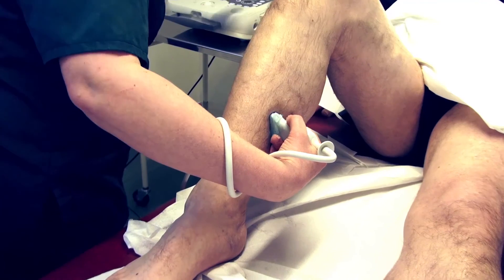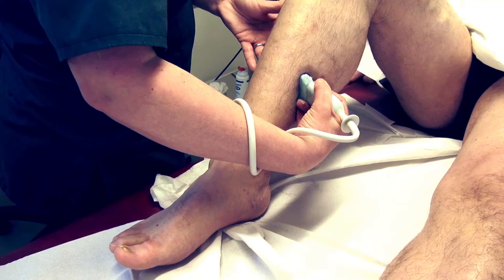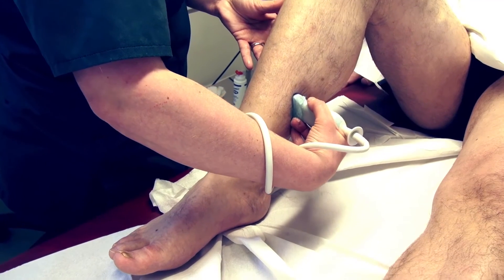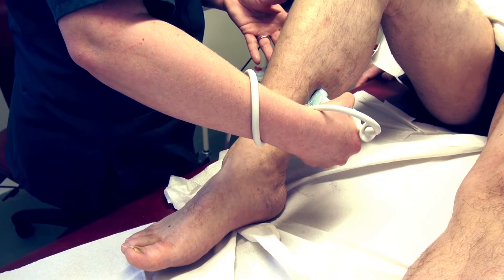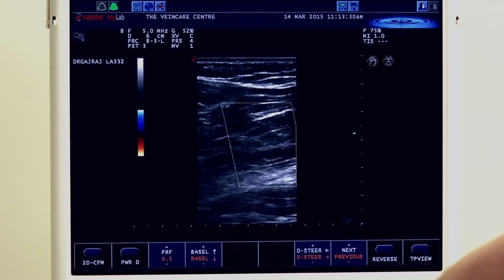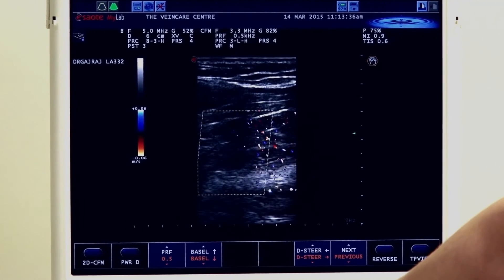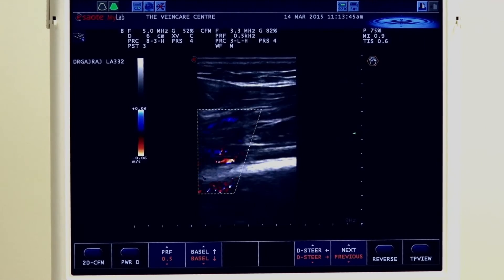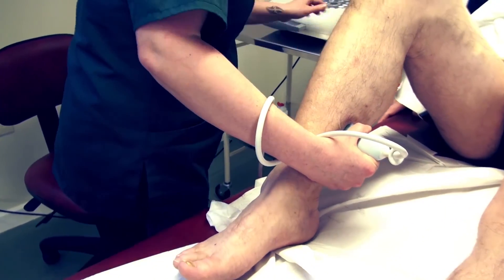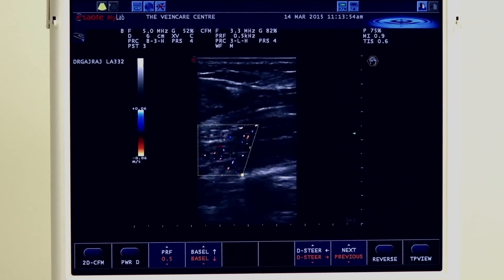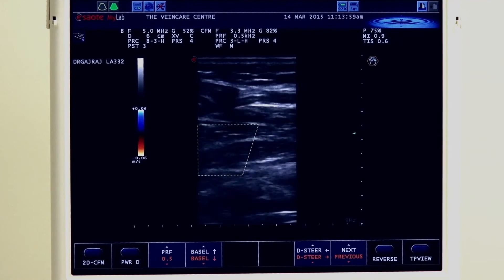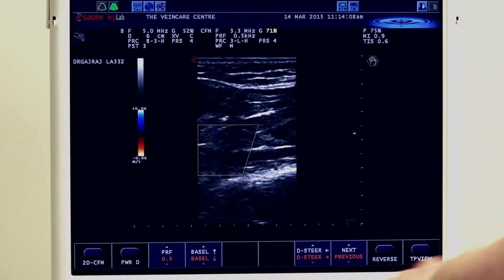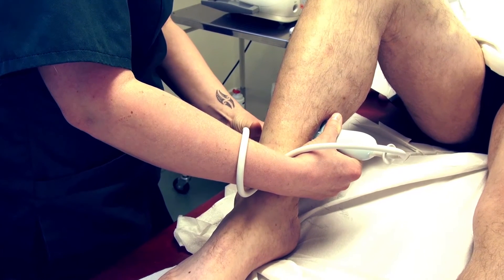The peroneal veins lie just on top of the fibula and can be identified here. Compression of those veins with the probe in a transverse position demonstrates good compression. Turning the probe 90 degrees shows a beautiful peroneal vein. Angling our colour box significantly picks up the best flow within the veins. We can also reduce our box size to ensure the best flow volume is captured. Reducing colour gain slightly to address some aliasing, then a nice little squeeze — and we can see flow within the peroneal vein.